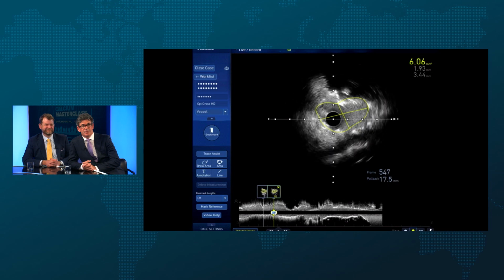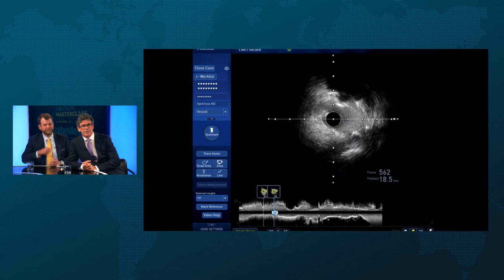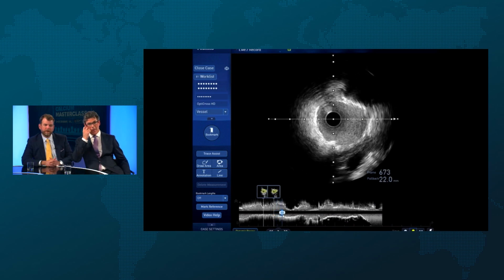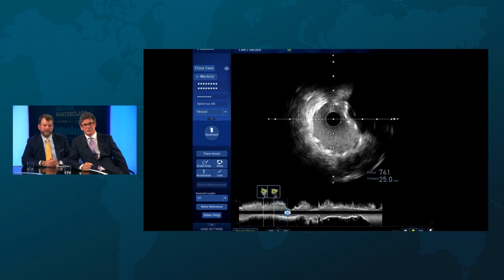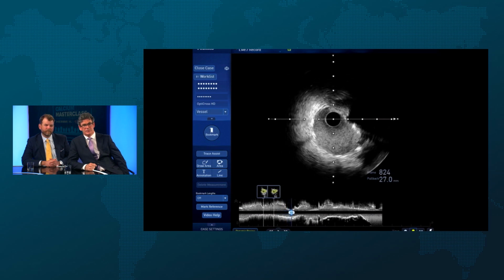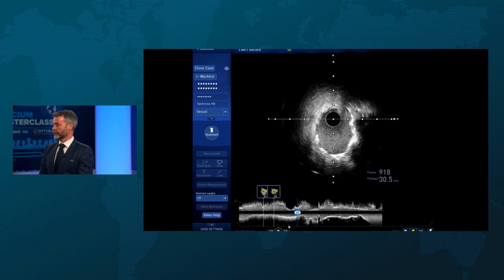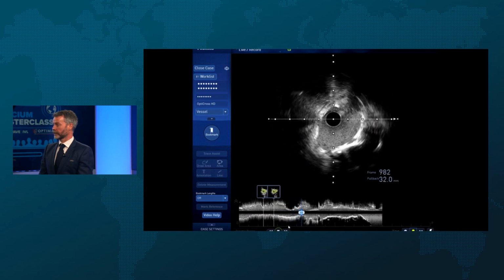So the classic situation with the good area, adequate area, but eccentric expansion, partially deformed by the nodule, and everything else is quite concentric, good again. It's been a really fascinating case with all these different morphologies and technical challenges. You've done really great. Really good case.